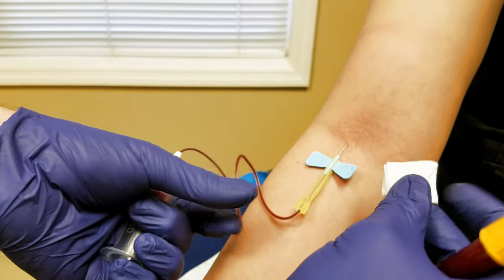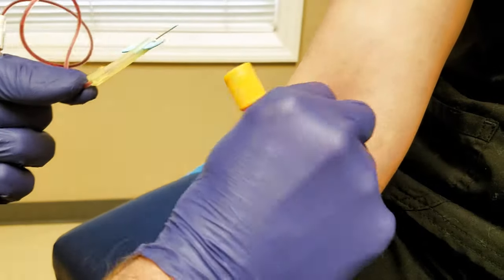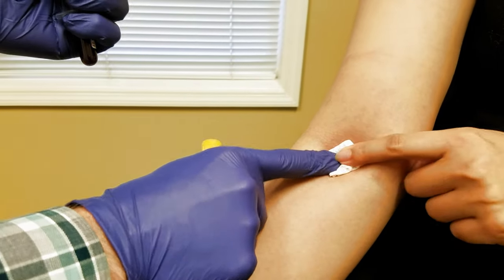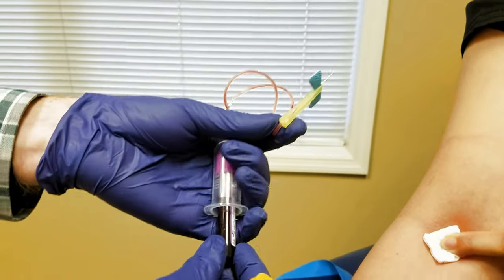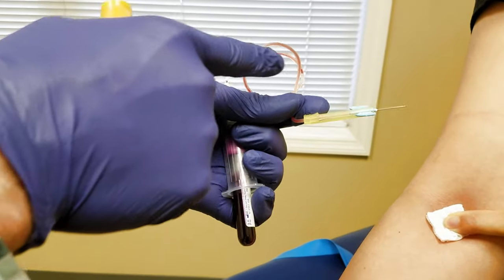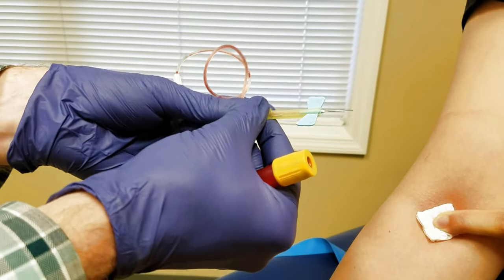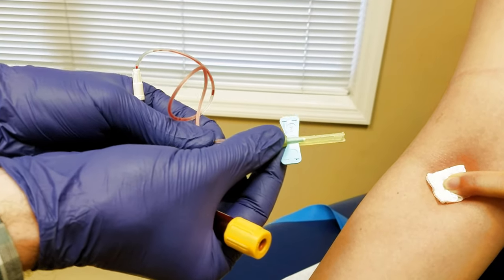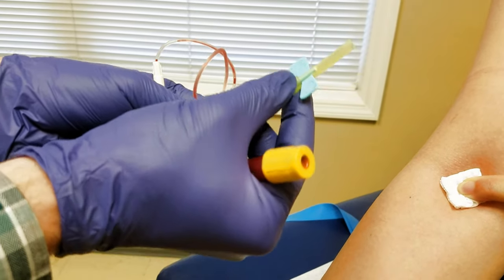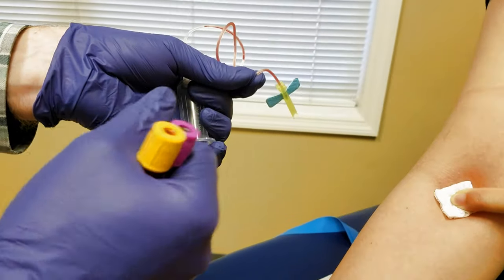Take the gauze and put it right over the needle without pressure, pull the needle out, then push down, and ask the patient to put their finger right here with a little pressure. Since there was a little suction left in the tube, the tube is clear of blood and it's not going to drip out. Push this down so the needle is protected, then take it over to the sharps container. Then you can pull your blood off.